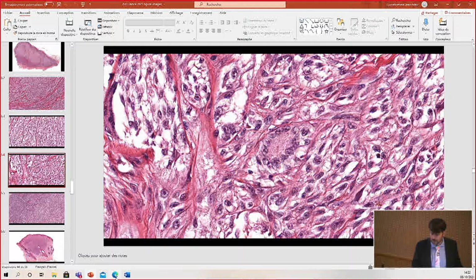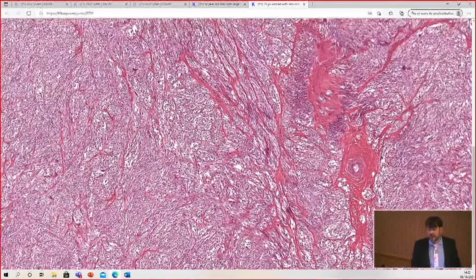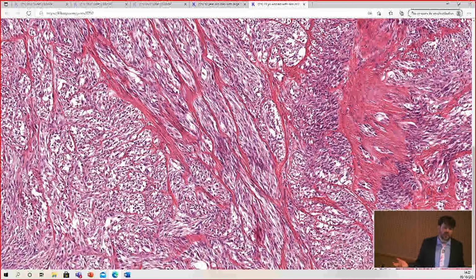Okay. There. So when they have classic morphology like this, great, clear cell sarcoma. You see it, you've done immunostains, it stains like melanoma, and then you recognize by the morphology, this must be clear cell sarcoma, and you do FISH or RT-PCR to show the fusion, which is EWSR1, the Ewing's gene, with ATF1 in most cases, and there is a rare variant fusion also.